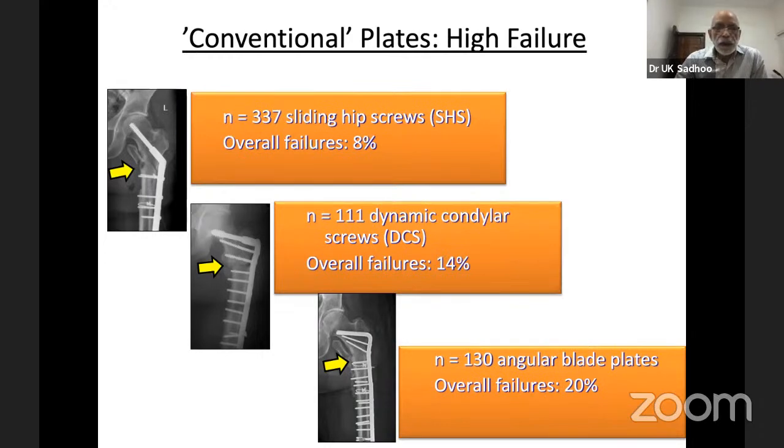And if you see here this void or the deficit medially, definitely predisposes to more varus, and the implant could fail laterally just opposite this. This is the reason nails are more preferred in this. They resist the bending stresses a lot more.